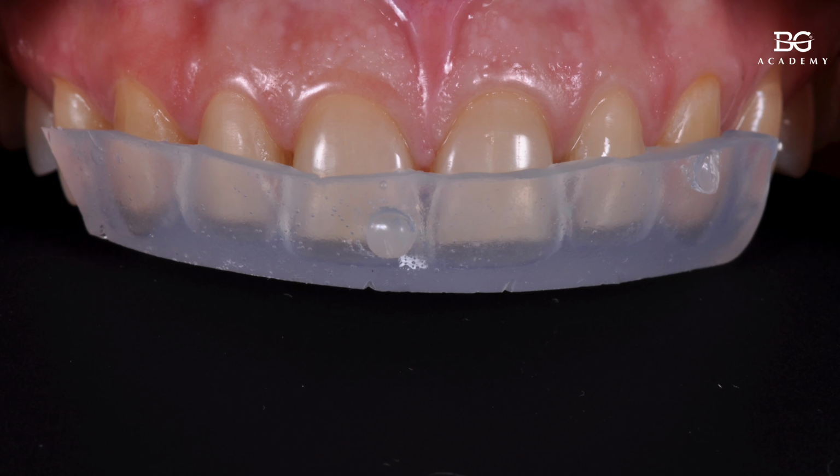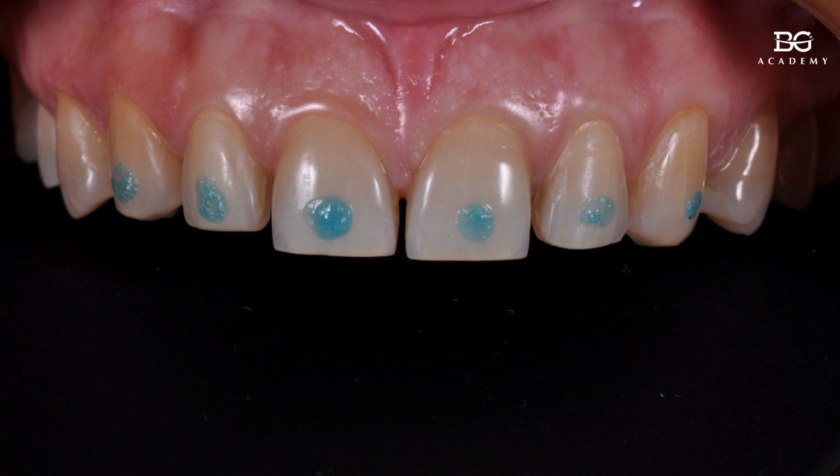So the method was offered by Galip Gürel initially, and you can see that the matrix is cut to the interproximal interdental papillas. Okay, so what's next? We just try the silicone index to see how it sits in the patient's mouth. Then we do spot etch. You can do line etch if you want to reinforce it more. I mean instead of these spots of etching gel, you can have two spots in the cervical area, in the incisal area, or just one line, as you wish.